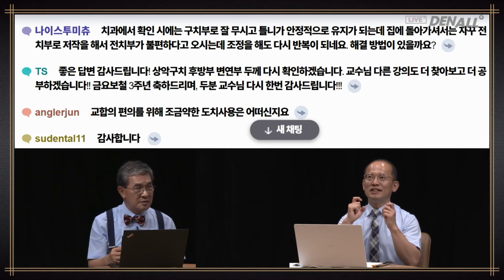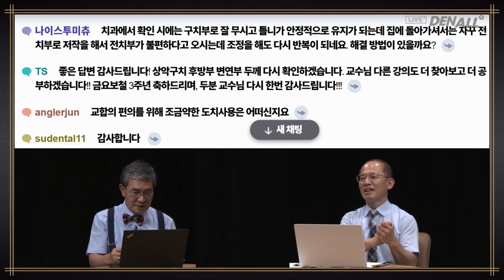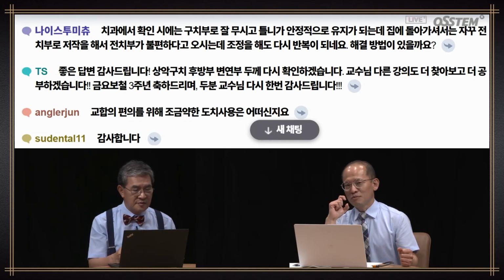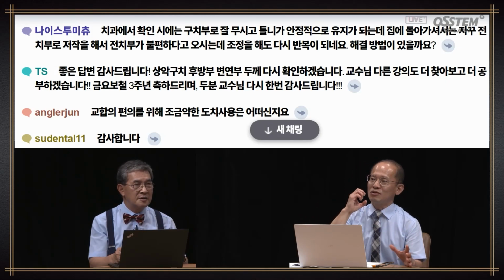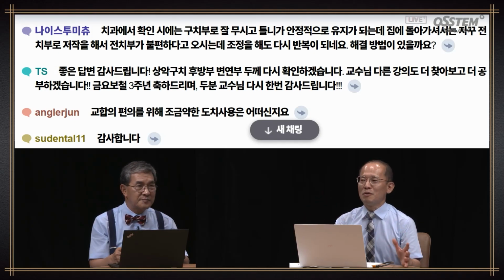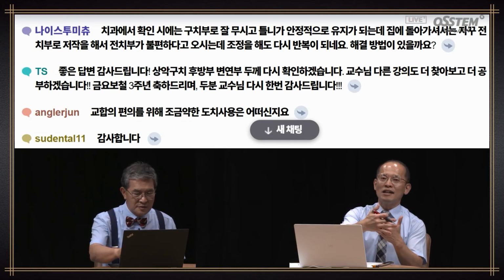had natural teeth remaining on the anterior side. If you have that, especially when you use the denture for the first time, you see this case. And secondly, whatever the case, the anterior clearance volume is not sufficient. Even if there's contact on the front side, you should have a lot of clearance on the anterior side. For both cases, you need sufficient clearance on the anterior side. That is what you need to do.